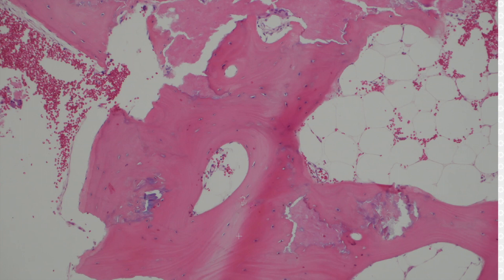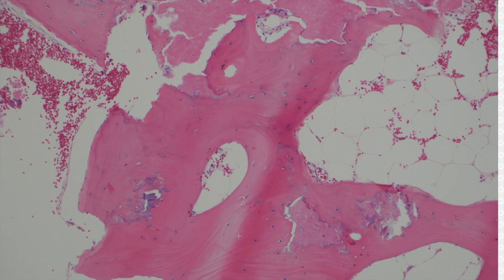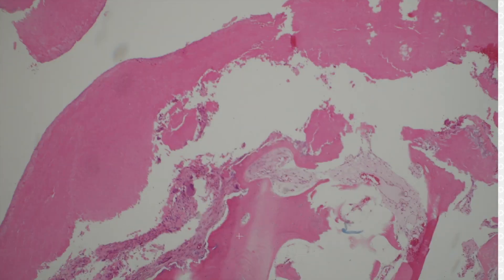That's kind of how you can tell real bone from just calcification — if you're lucky, you'll get those lamellar lines and you'll see osteocytes in it. And depending on if it was decalcified or not, it may be pink or purple or a mixture of those. It kind of depends on the case.